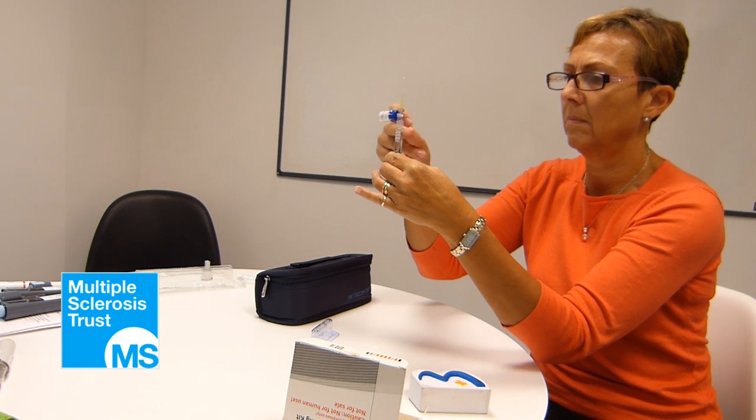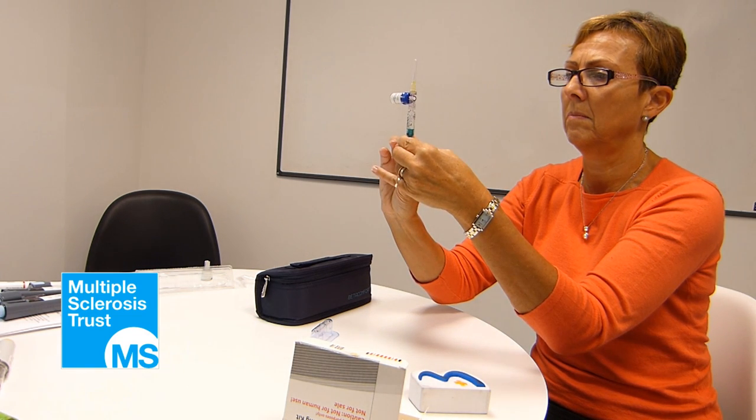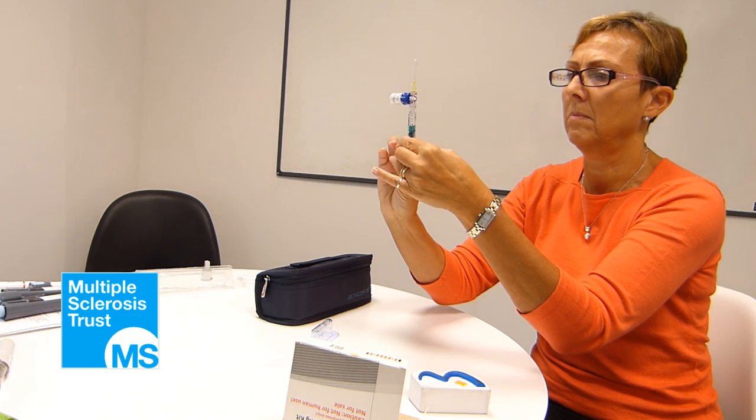Gently tap the syringe. Push the bubbles slowly back into the vial so that you end up with one ml of Beta-Pheron solution in the syringe.